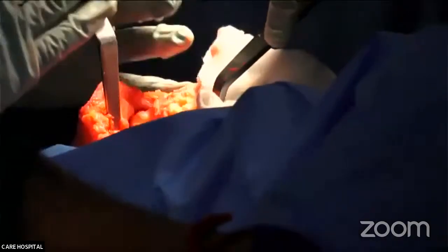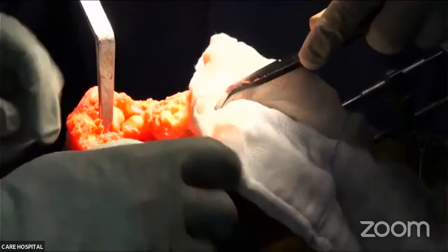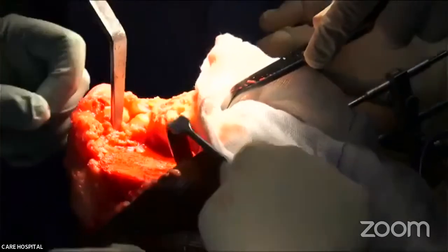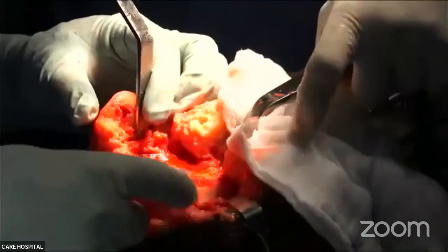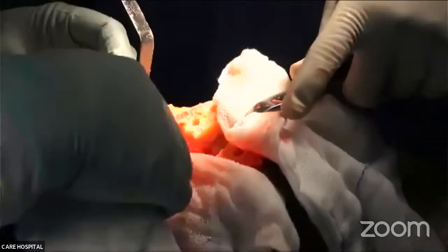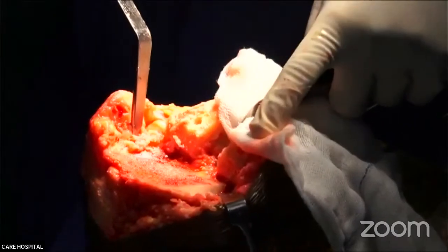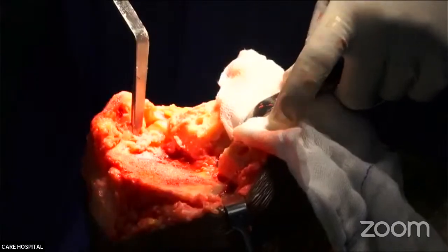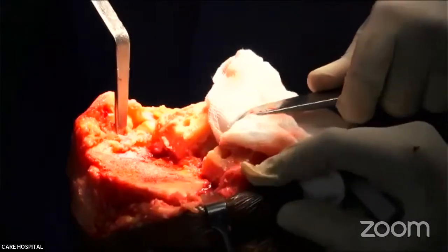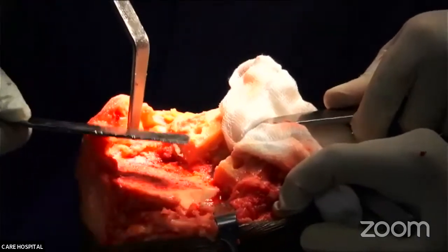One minute, let me show the defect. One Homan, one more. So you can see that there's a defect there. Can you see there? Show a base plate. Osteotome. So Dr. Padi, can you see the defect on the medial aspect?